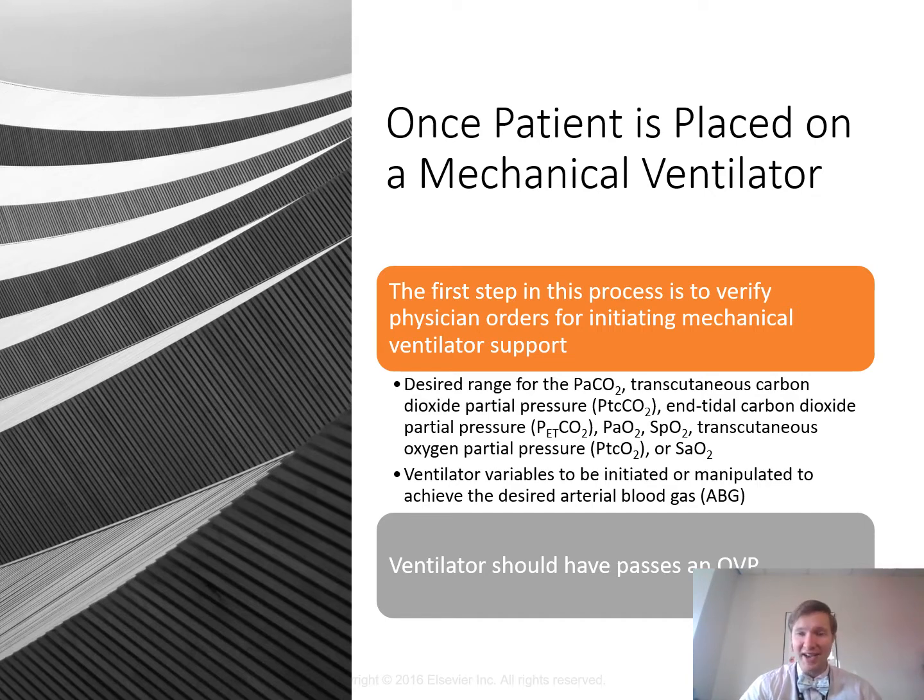I'm a huge fan of end-tidal carbon dioxide, which is what you see here. End-tidal carbon dioxide is one of my favorite assessments to do on these patients. I always enjoyed using this because it can tell me if there was a dead space process going on. It can also tell me if the patient's cardiac output is changing, right? If their perfusion's starting to go downhill, if they start to lose vascular tone or cardiac tone, then that end-tidal is going to drop. If they start to have a dead space process where I'm hyperinflating the lungs and impeding blood flow through the lungs, then the end-tidal CO2 is going to drop, right? So it can be a very valuable assessment, not only for ventilation standards, but also for perfusion standards as well.